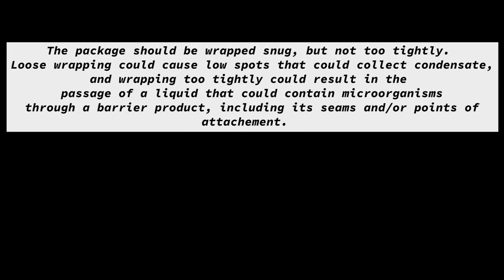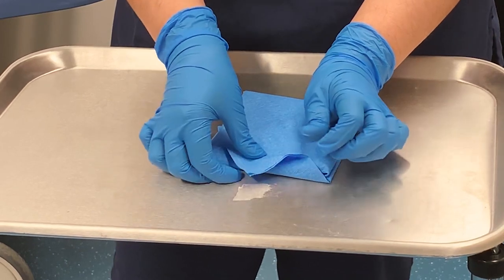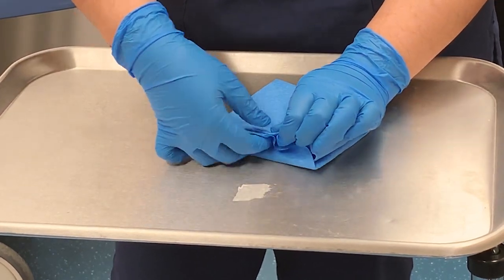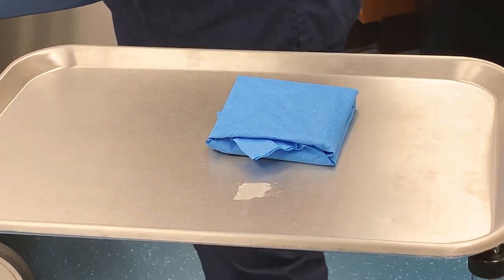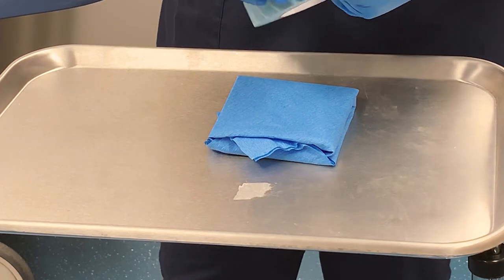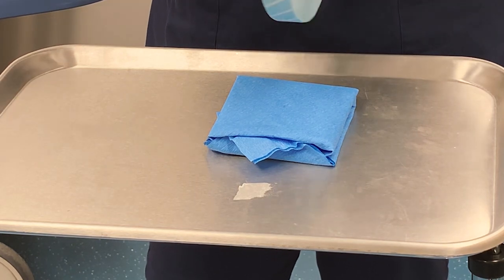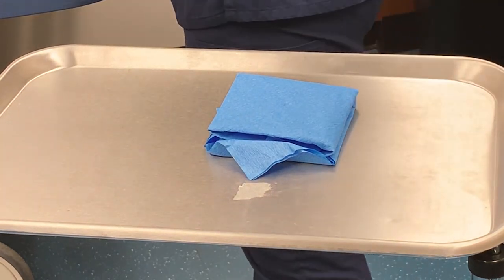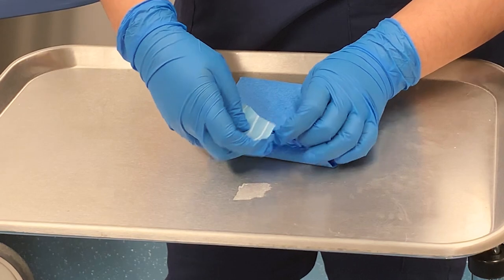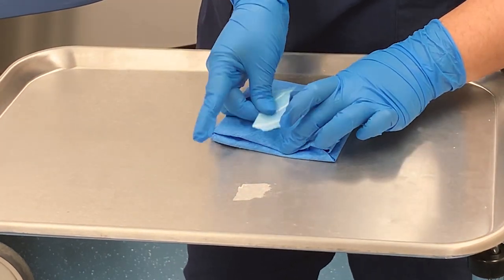I'm going to make this a little tighter up here and make the tab a little bigger. Now you're going to grab your indicator tape and fold the little corner over itself so that it's easy access. And you're going to take this little tab closed.